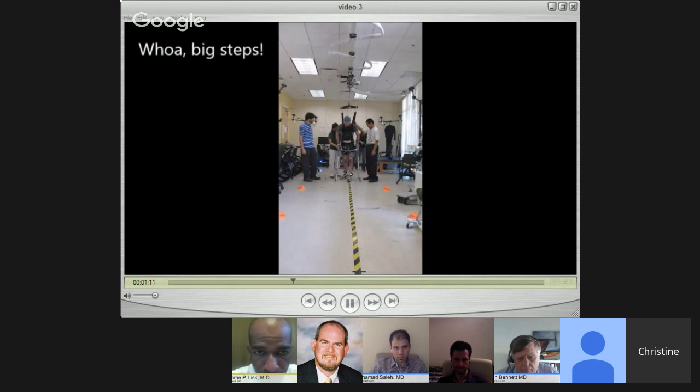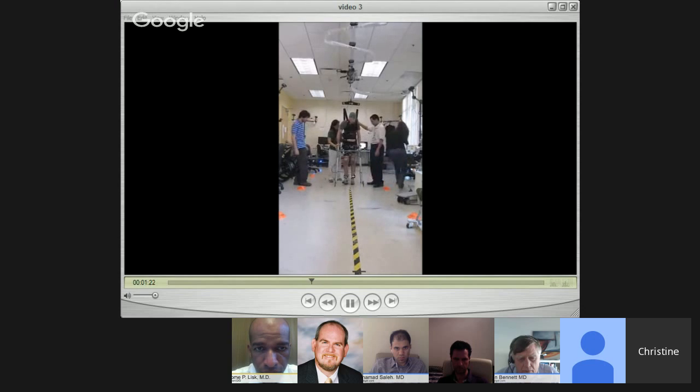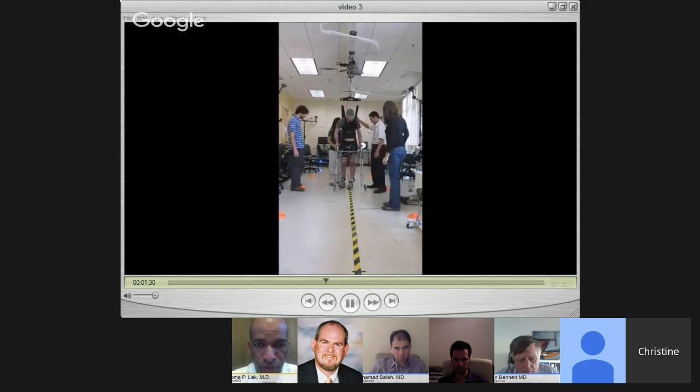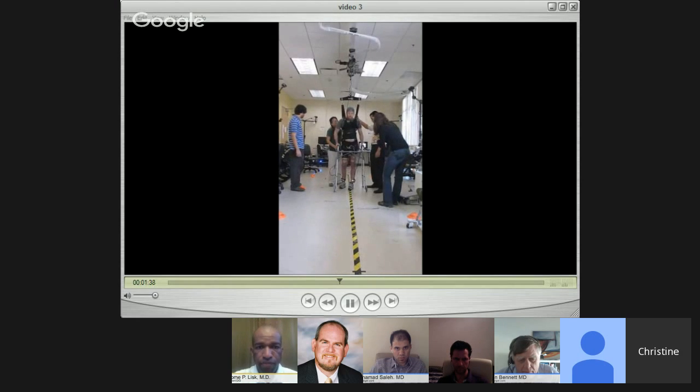Obviously, it's a little crude because we're using FES, and he has to work on a lot of postural stability as well as weight shifting. Once he got really good at doing that, he's able to walk in a better cyclic-like pattern. Now he's going to approach a cone, so this is our little game, just like in the virtual reality, and I say, stop and relax, and remain idle for as long as you can. You can see it takes a second, but he's able to stop, and now he will go into a standing state. From there, I can then ask him to start walking again.